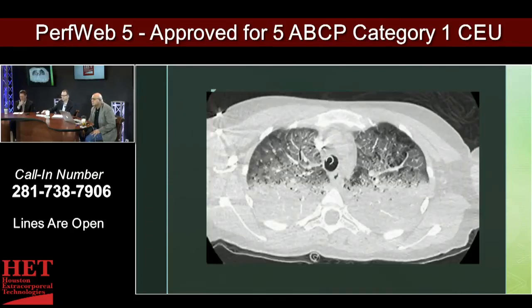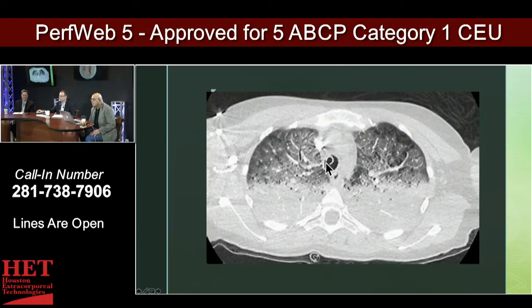This is a classic example of what aspiration pneumonia would look like — rather than ARDS — with significant effusions developing. This is a classic example of dependent atelectasis in a patient sick in the ICU. This is the trachea and the endotracheal tube within the trachea. So this is an intubated patient, probably laying flat for a long time, with dependent atelectasis where small airways collapse and fill with fluid, mucus, et cetera.